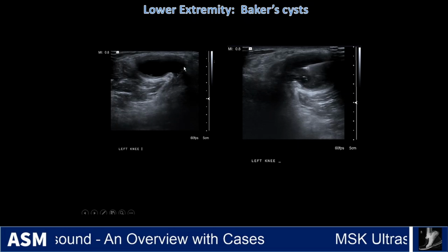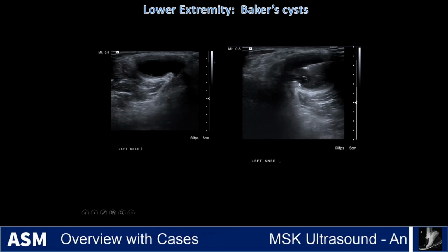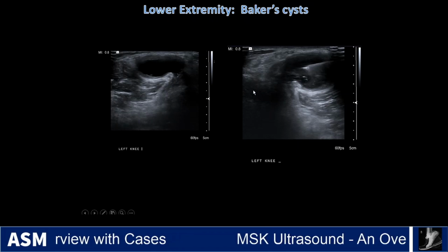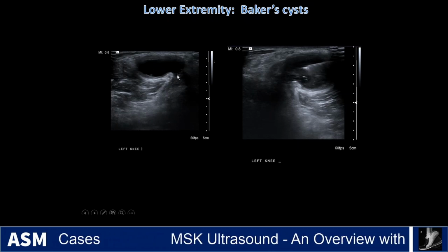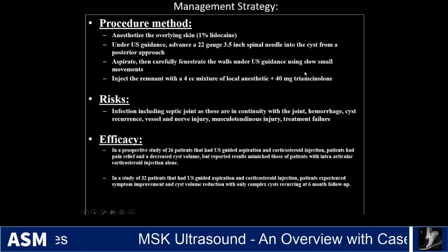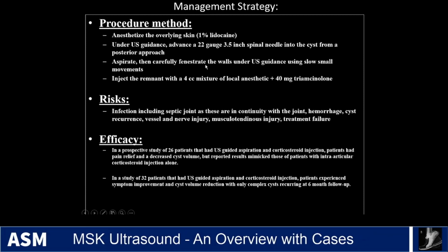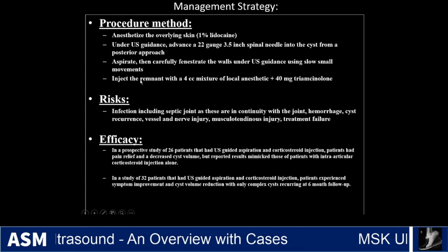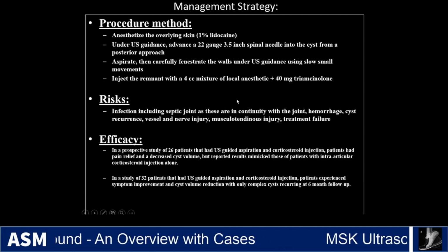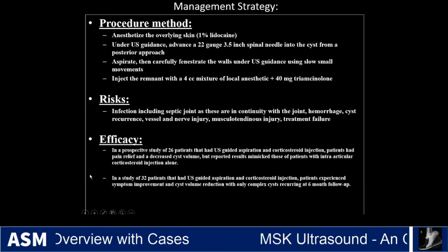Baker's cyst, the same thing. So you can always come into it and aspirate and fenestrate, put steroids in. This may reaccumulate, but for symptomatic patients, this is a potential option that's non-surgical. Sterile technique, anesthetize the skin, aspirate, lavage if necessary, and fenestrate the walls carefully, the risks associated with it, and then efficacy of this procedure.